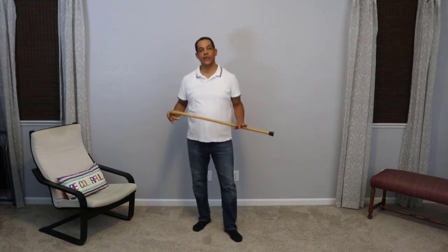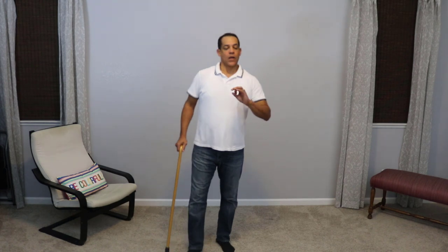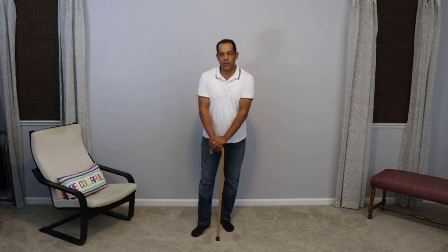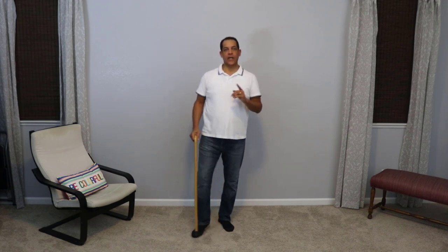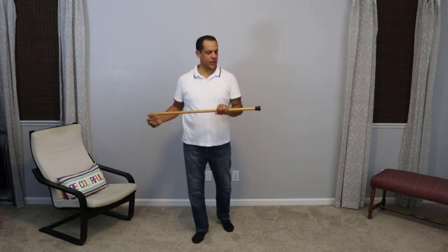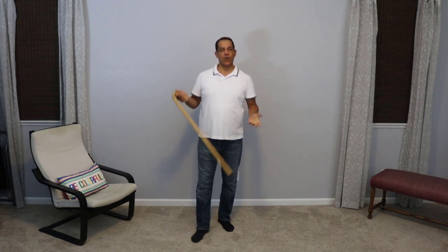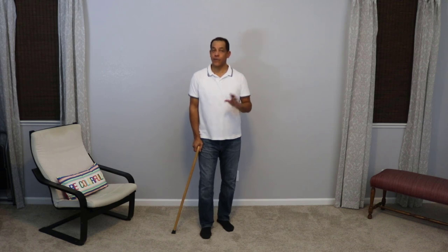Today we're going to look at how to use a cane with a bad knee. Using a cane is very simple. Basically, the bottom line is that when you're using a cane — whether it's a standard or straight cane like this, or a quad cane or something like that — you want to use it in the opposite hand of your bad knee.